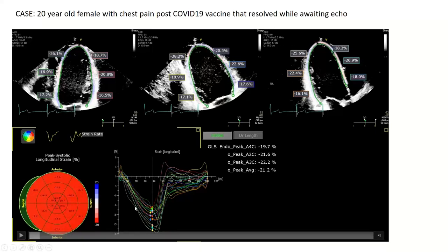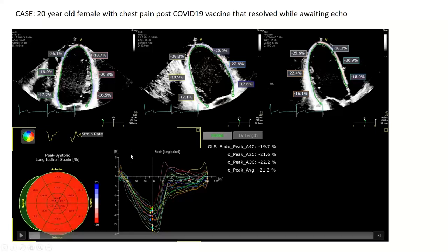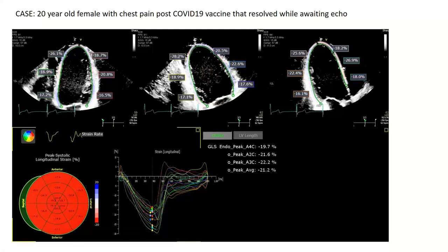The strain analysis window also shows the strain curve: on the y-axis is strain percent, and on the x-axis is time. The dotted blue line marks where aortic valve closure occurs — the system sets that automatically but allows quality control to ensure it's in the correct place. In broad strokes, we expect shortening to occur in systole and lengthening of the fibers in diastole. But there's a lot more to the strain curves, so in the next few slides we'll focus on understanding what we can see.